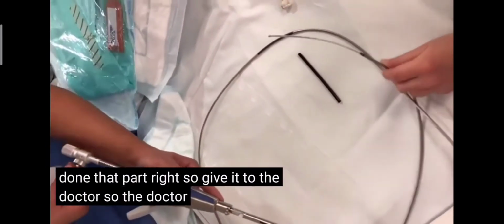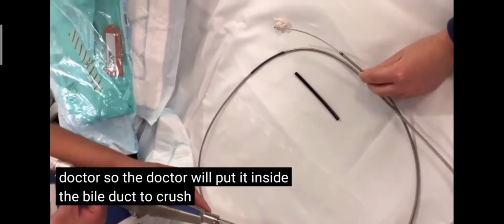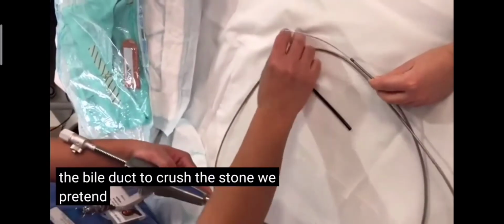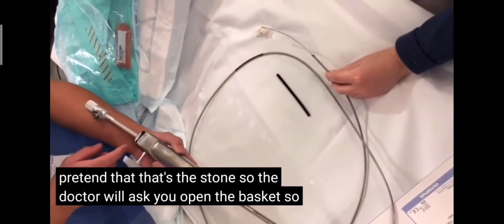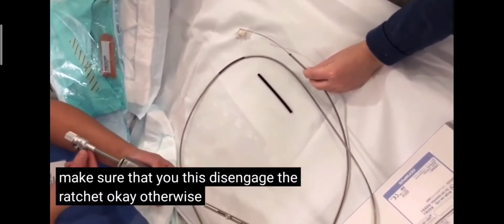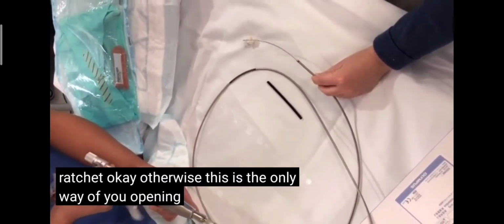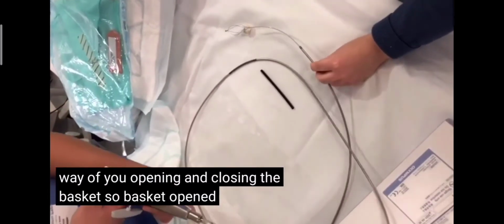So the doctor will put it inside the bile duct to crush the stone. We pretend that that's the stone. So the doctor will ask you to open the basket. Make sure that you disengage the ratchet, otherwise this is the only way of you opening and closing the basket. So basket open.